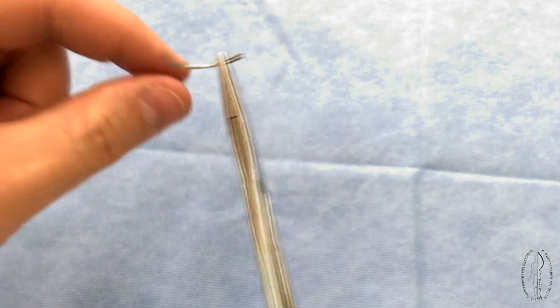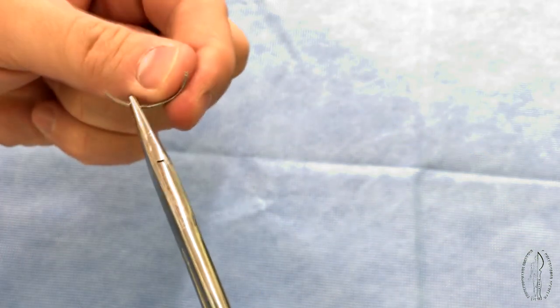Fixation of the needle closer to the middle or near the eyes is incorrect.